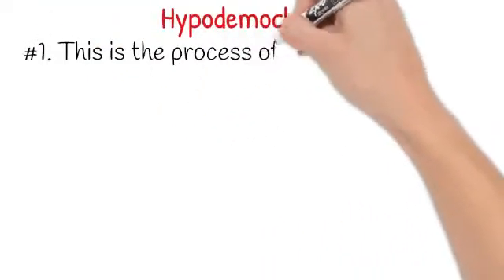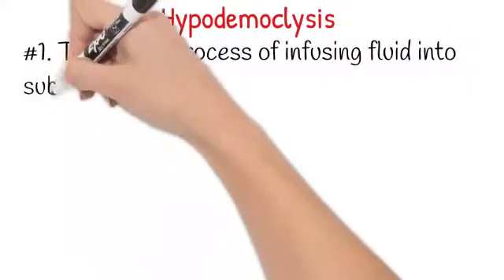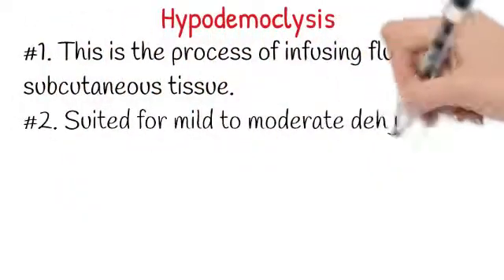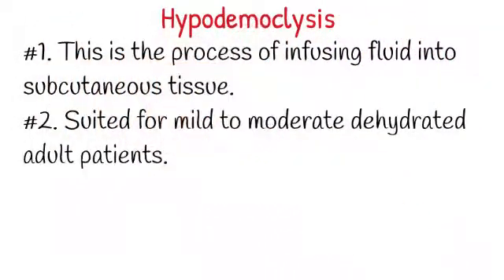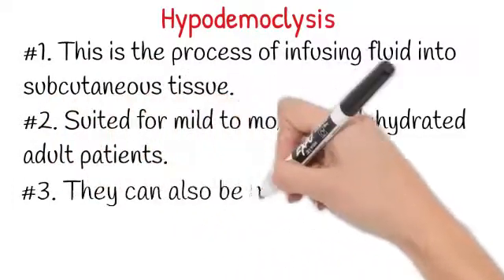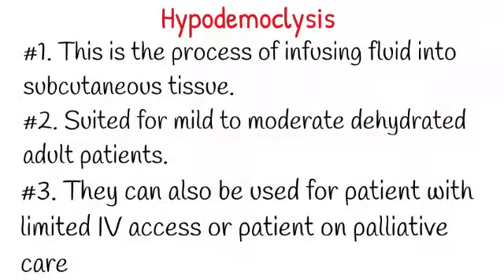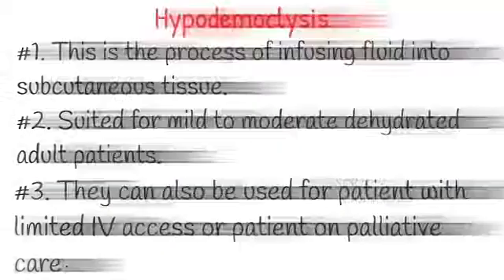Hypodermoclysis. This is the process of infusing fluid into subcutaneous tissues. It is suited for mild to moderately dehydrated adult patients. It can also be used for patients with limited IV access or patients on palliative care.